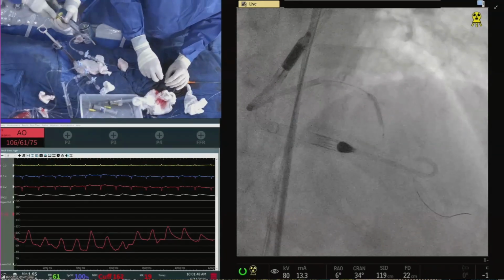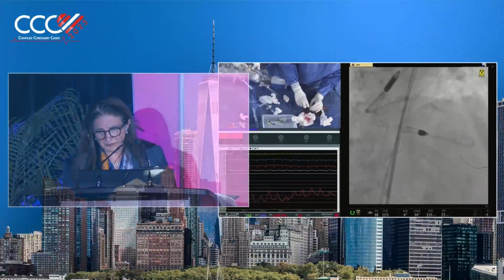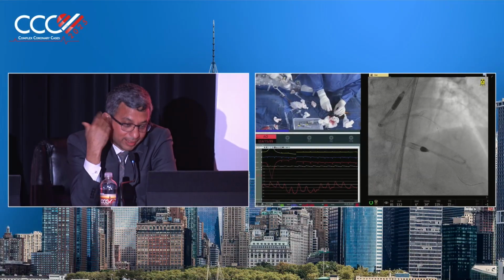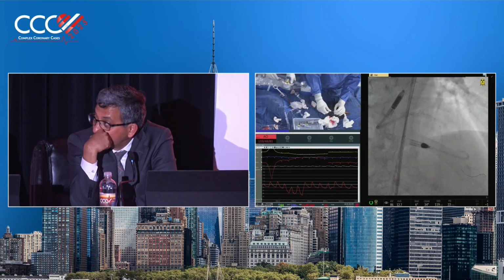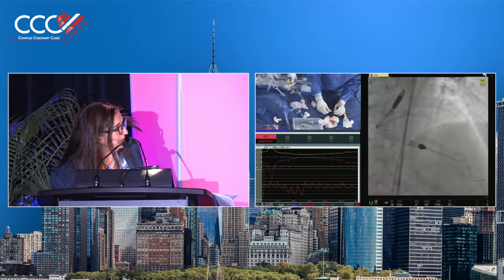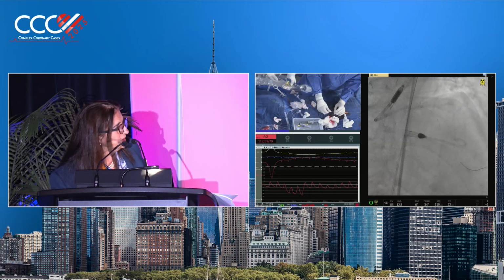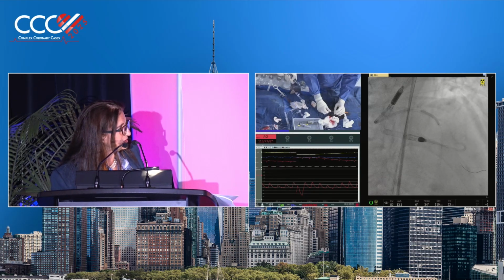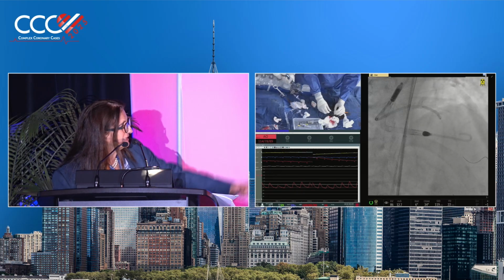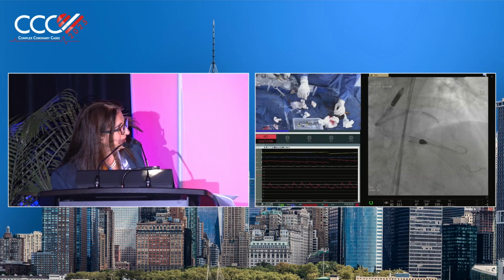Done. But I do agree that we are using a lot of devices in general. If they wanted to use a drug-coated balloon in combination with Impella, would you even allow that? Because we heard from Sunil, he's got it locked up in the cabinets. He's not letting people anywhere close to it unless the patient is in a trial. Is that what's happening at the Cleveland Clinic too?